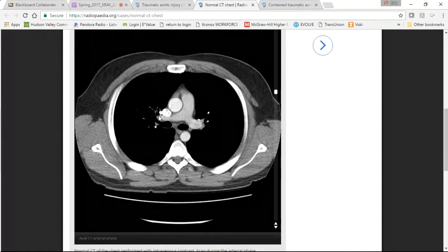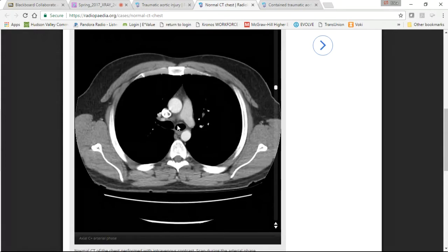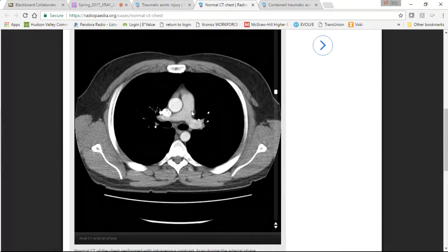And if I keep going down, I have my right and left main branches, which we'll go over in the circulatory system next week. But for a CAT scan tech who's looking for a PE, which is a thrombus in the pulmonary artery, a pulmonary embolus, this is where you're going to be looking, all right? So understanding that it literally is millimeters inferiorly from the level of the carina will help you to locate it when you have to do certain ROI slices to make sure that we have enough contrast in these vessels right here. It's also going to help you find these vessels.